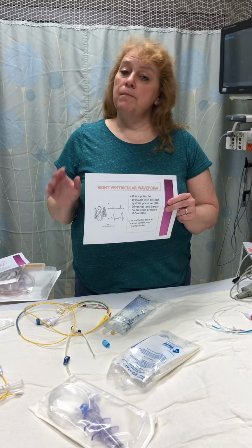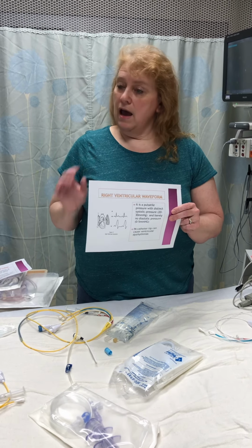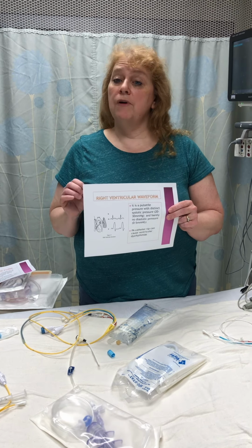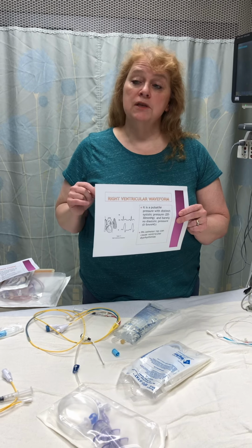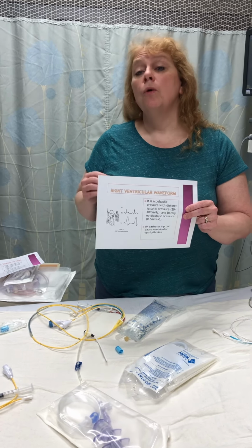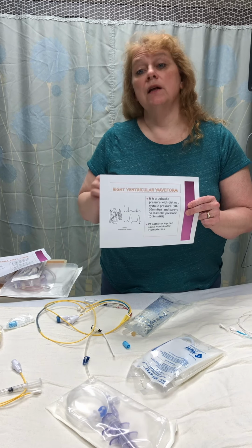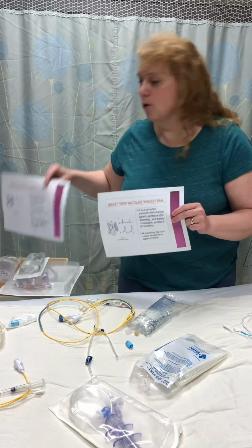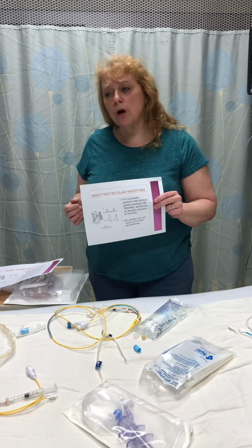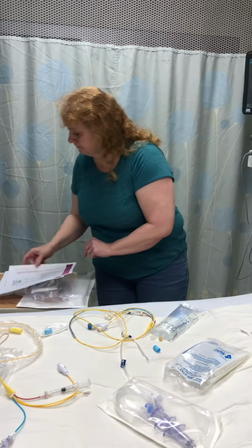If the patient is having runs of VTAC, you would want to notify them and have them come to the bedside, but if they're tied up in another room, as a nurse, we can withdraw the Swan a little bit until it goes back to your CVP waveform. We can withdraw, we just can't push forward.